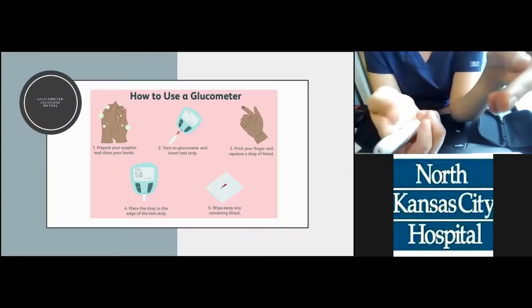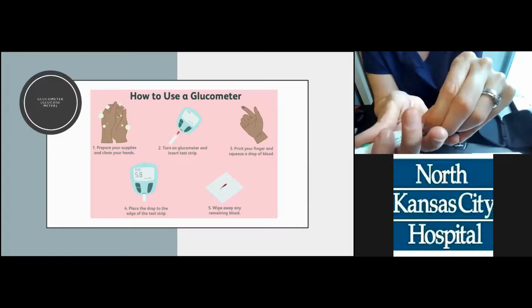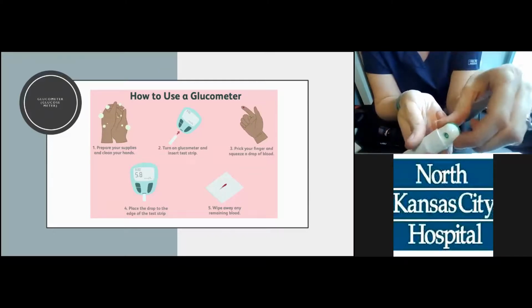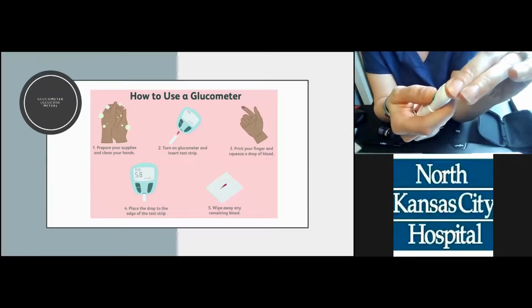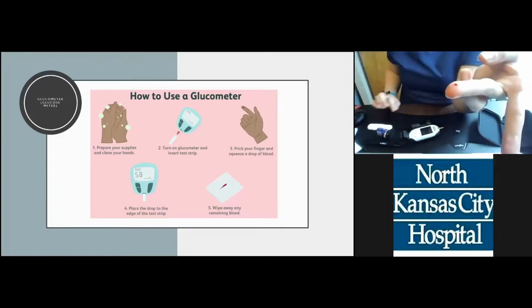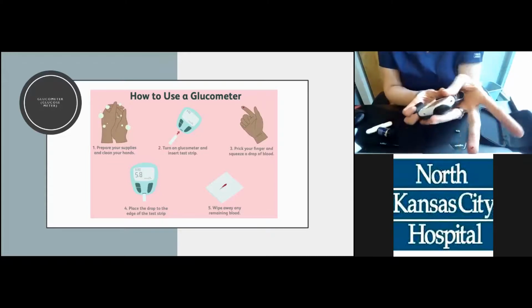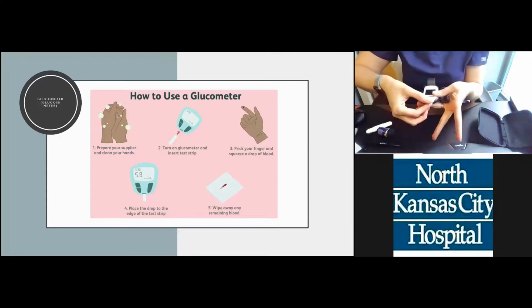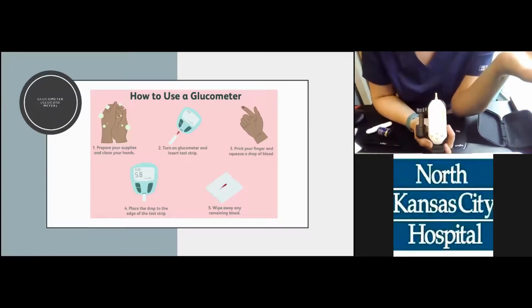Well, I felt a bit, but no blood came out. So now I'm going to go up to 4. Okay, so I turned it up to 4, pull back, put it on my finger, and stick. Woo, felt it that time. And look at all that blood. Okay, so now I go to put it on my meter, and my meter is turned off. That's because it took me a minute to get the blood. So I'm going to take the strip out and put it back in, and it turns back on. And I'm going to wait until it tells me apply some blood.